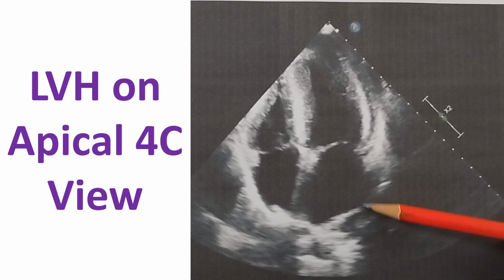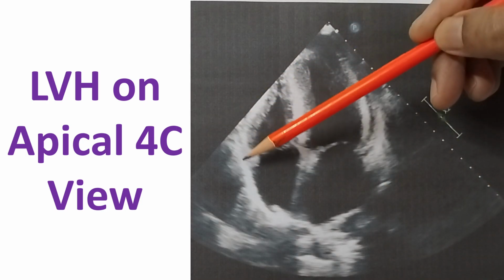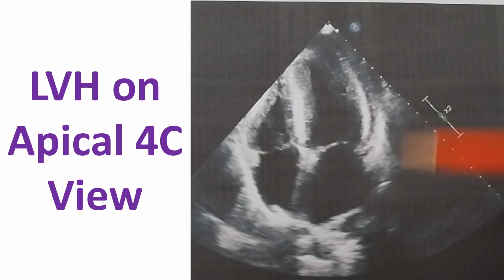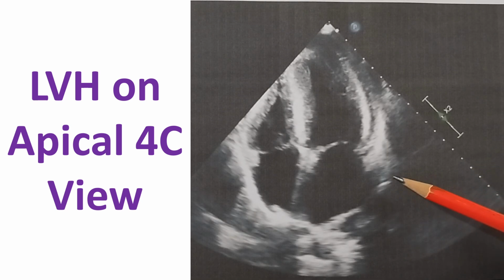And these translucencies are the pulmonary veins draining into the left atrium. We can see that the right atrial wall is rather smooth without any translucency, while there are translucencies here. Usually we see 3 pulmonary veins draining into the left atrium. In live image you can see it better, and you'll also be able to see the color flow in color Doppler. You can see the blood flowing, or rather the Doppler signals of blood flowing from the pulmonary veins into the left atrium.